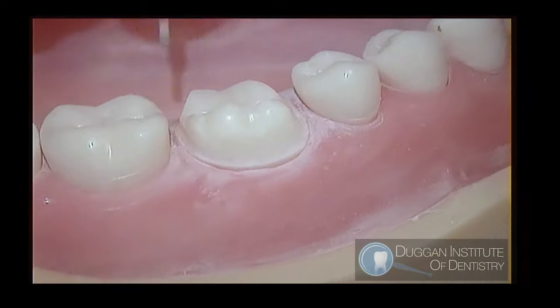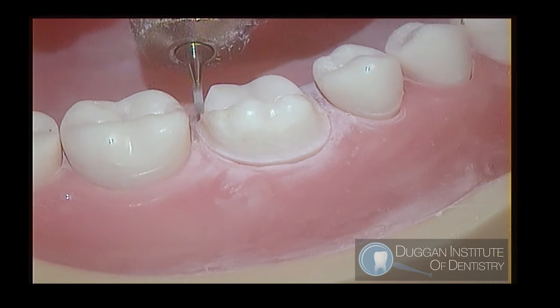A thin bevel should be placed on the functional and non-functional cusps.